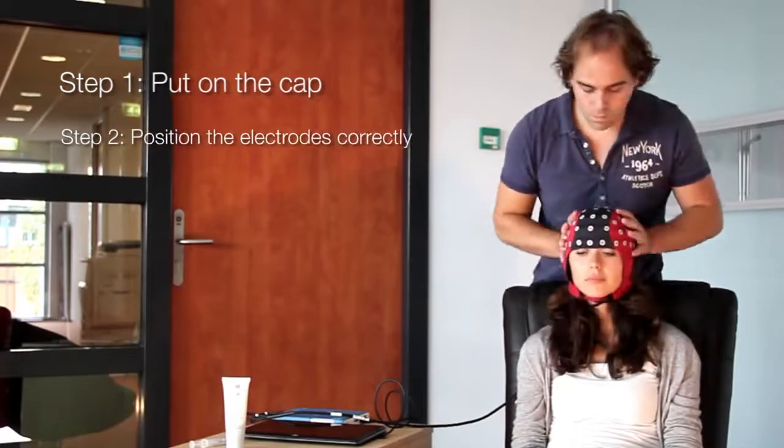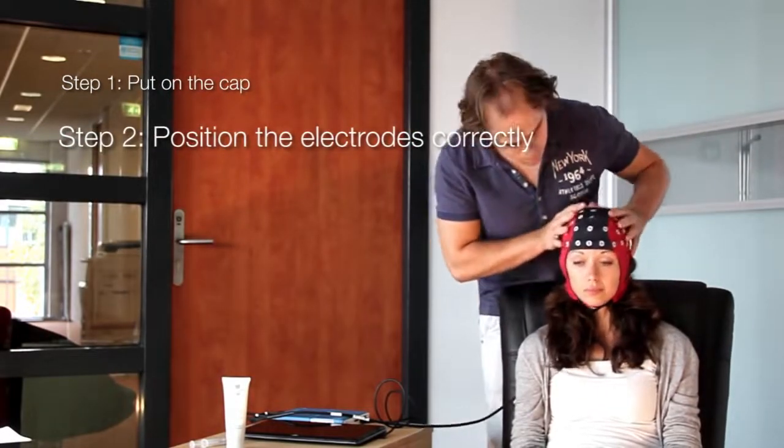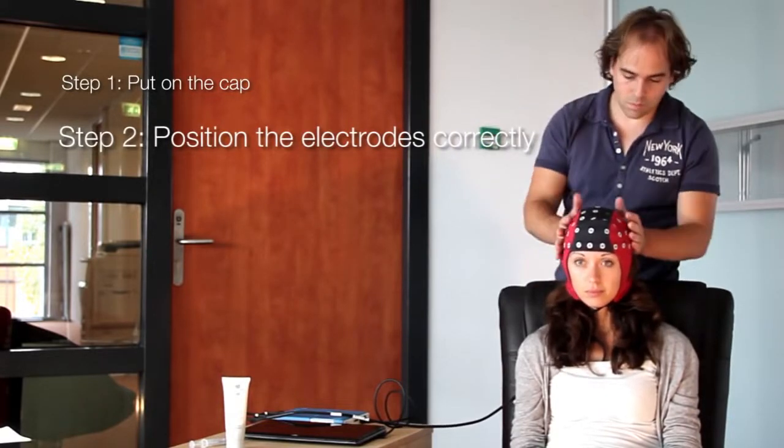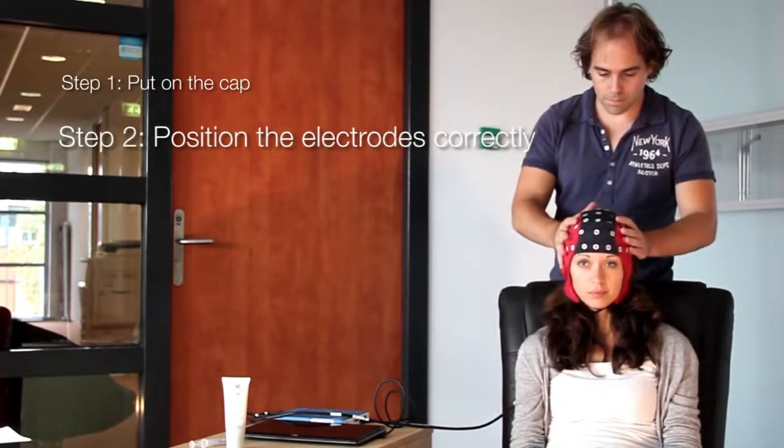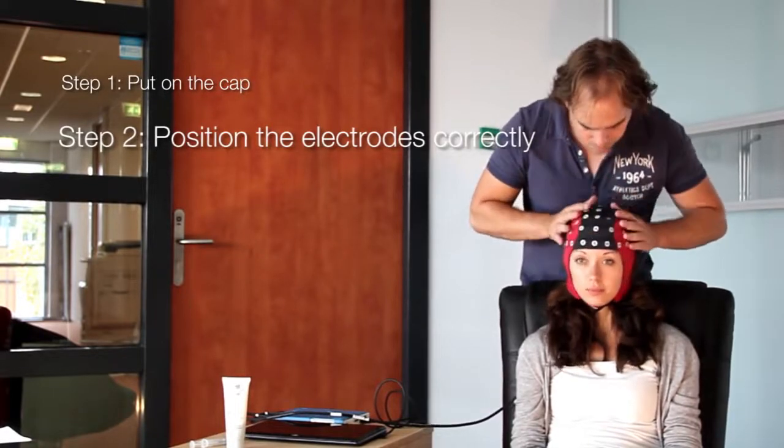Try to position the cap so that the electrodes fall over the proper positions. Check that the fabric is smooth and not wrinkled. Check that the cap is applied symmetrically with the midline electrodes over the nasion-inion line and that the cap is properly centered.